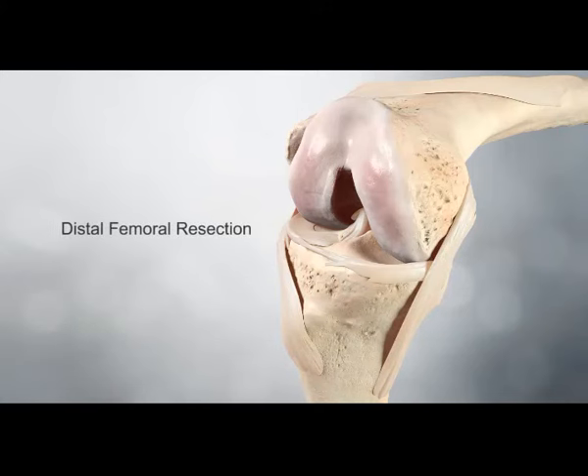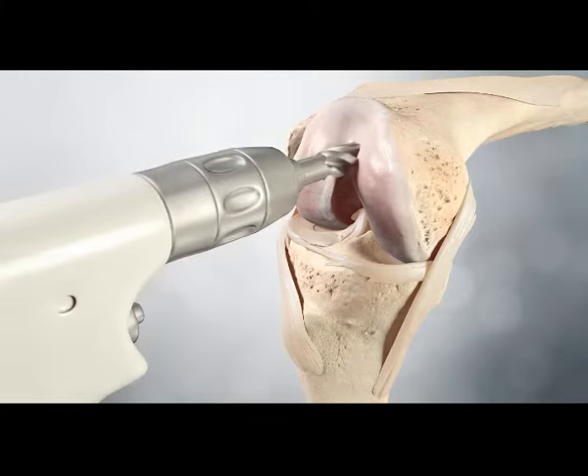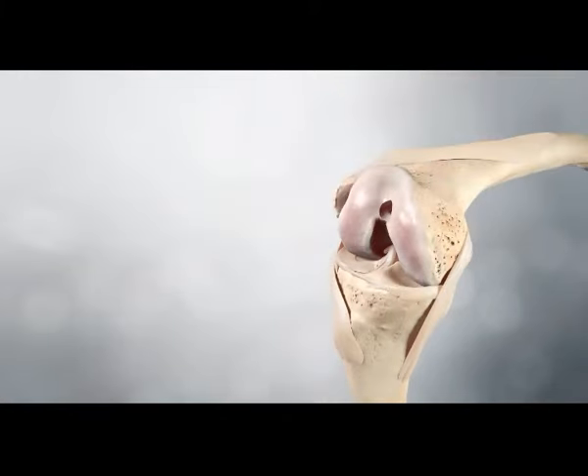Distal femoral resection. The step drill is positioned to enter the intramedullary canal slightly superior and medial to the midline of the trochlea. In this position, the drill should pass easily into the femoral canal and its step feature increases the diameter of the hole.